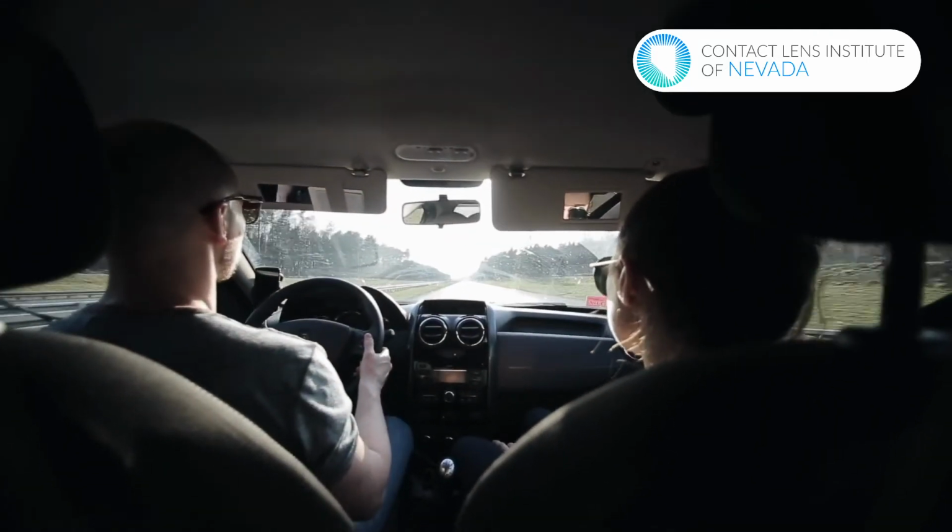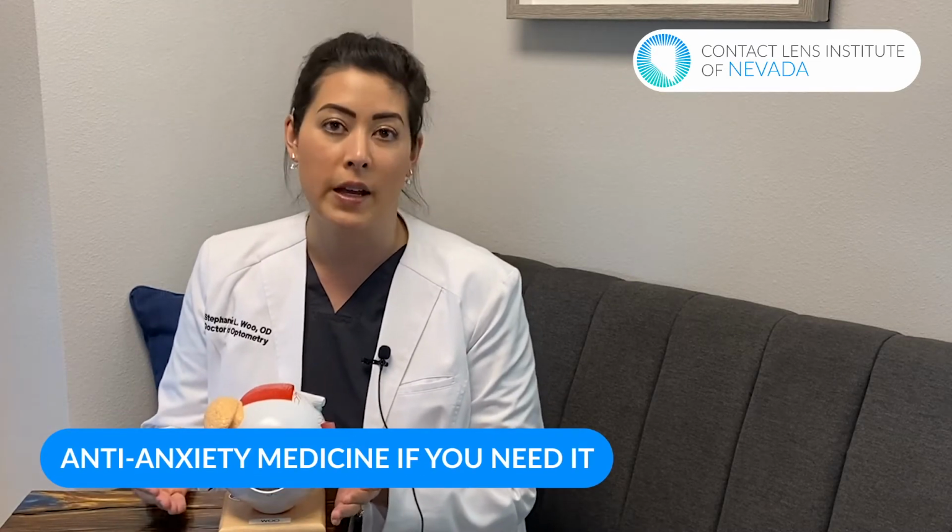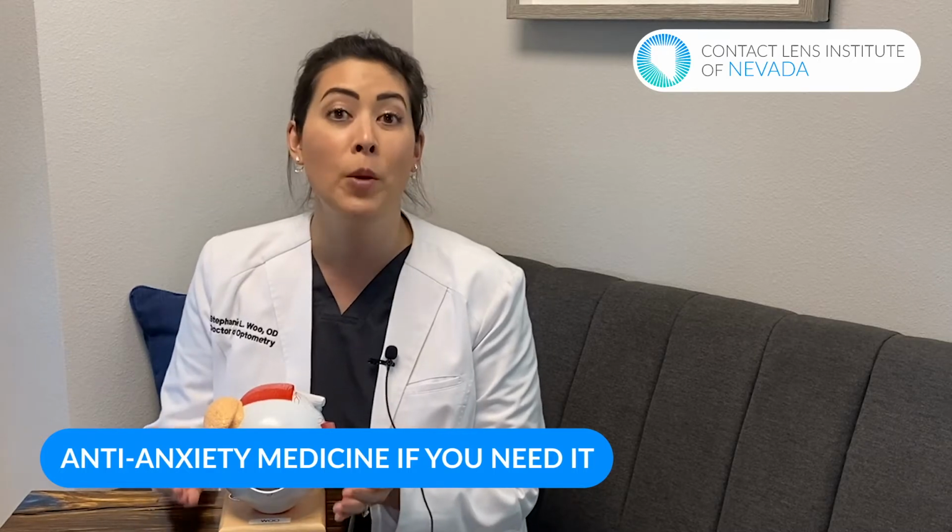You're going to have somebody take you to the clinic, and they'll give you some anti-anxiety medicine if you need it, something like Xanax or something else that will calm you down if you're really nervous about it. You kind of hang out in the lobby, and then when it's your turn, you will go back into the operating room and they'll get your eye prepped. You basically just lay down. Most patients actually wear their own clothes. You don't have to change into anything special for the most part. You lay down onto a little bed and they prepare your eye.